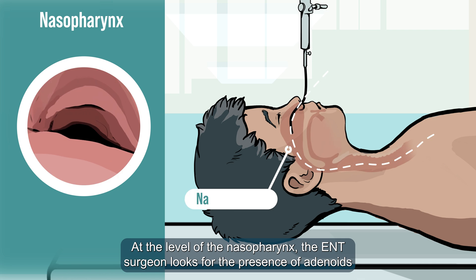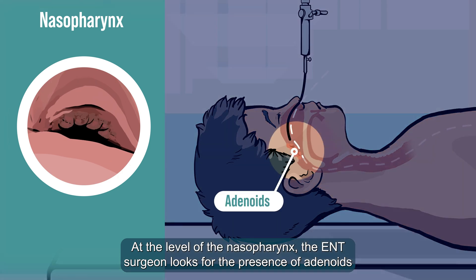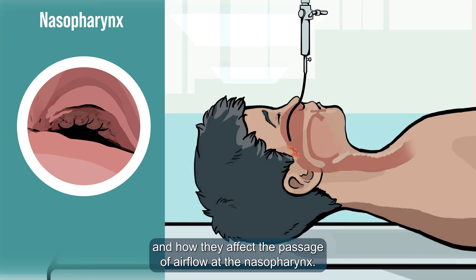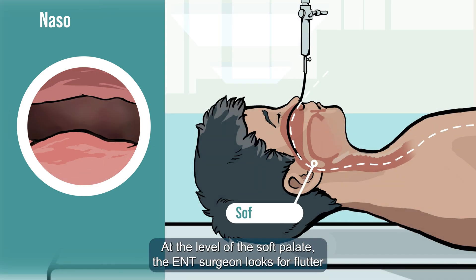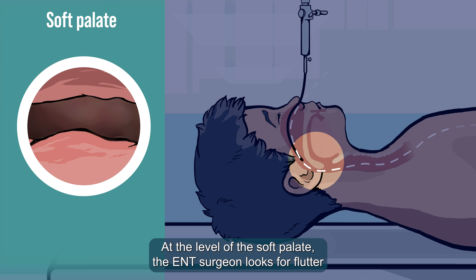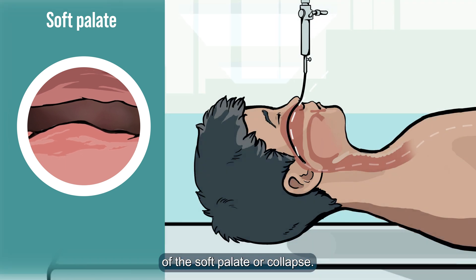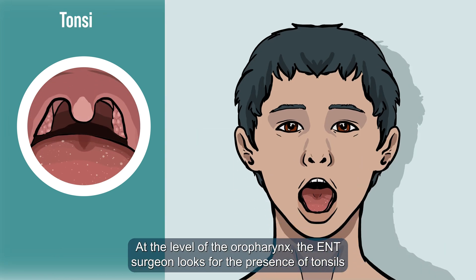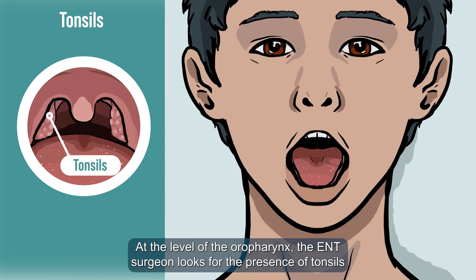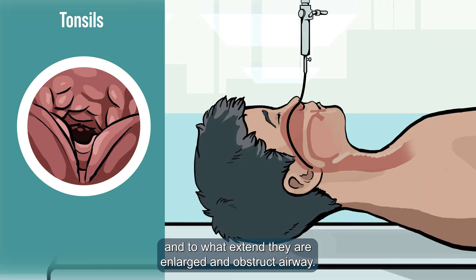At the level of the nasopharynx, the ENT surgeon looks for the presence of adenoids and how they affect the passage of airflow at the nasopharynx. At the level of the soft palate, the ENT surgeon looks for flutter of the soft palate or collapse. At the level of the oropharynx, the ENT surgeon looks for the presence of tonsils and to what extent they are enlarged and obstruct the airway.